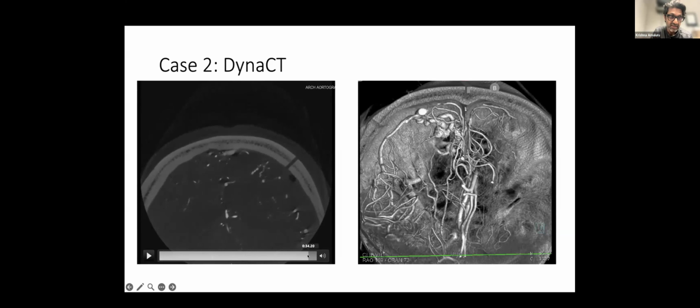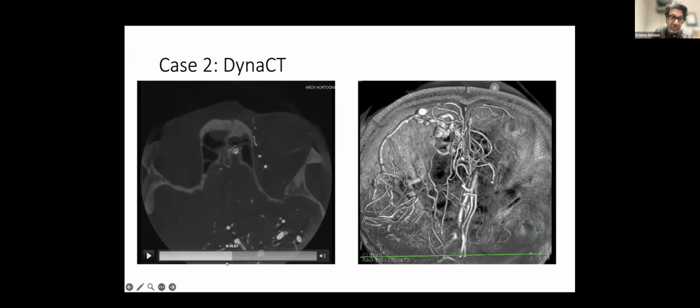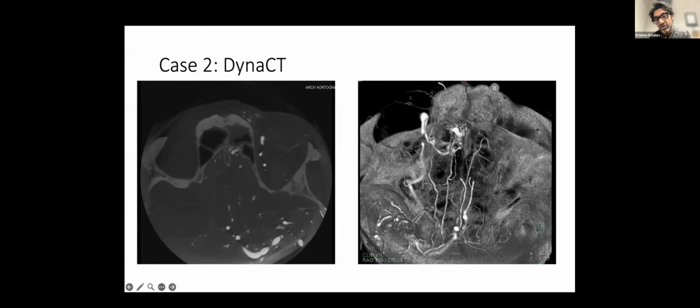You can see that the dumping of the sinus into this pial vein can sometimes be a very low caliber, almost like a sheet of vessel. And trying to get 2 microcatheters, let alone an intermediate catheter across this transition can be very challenging. Even getting 1 microcatheter across this transition can be very challenging. So we didn't really think that there was a good venous route into this fistula. Here's the iterative reconstruction.